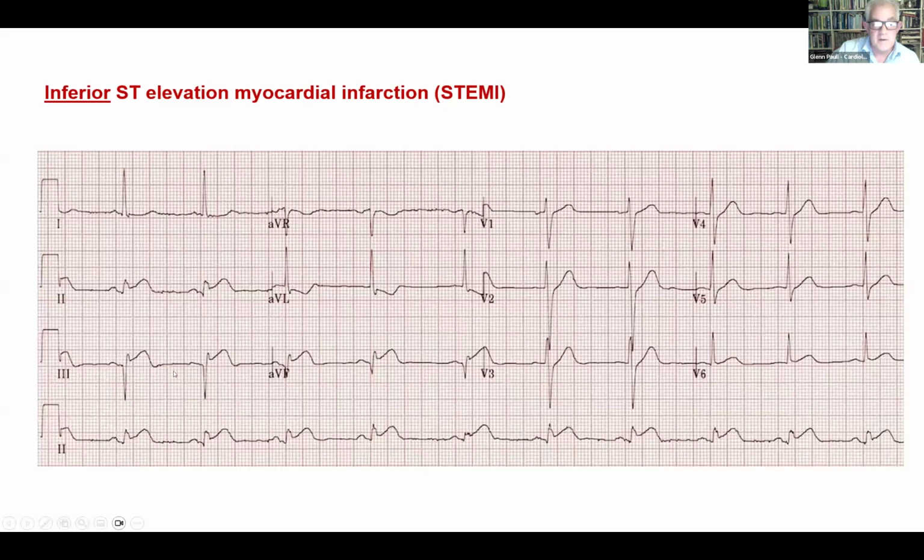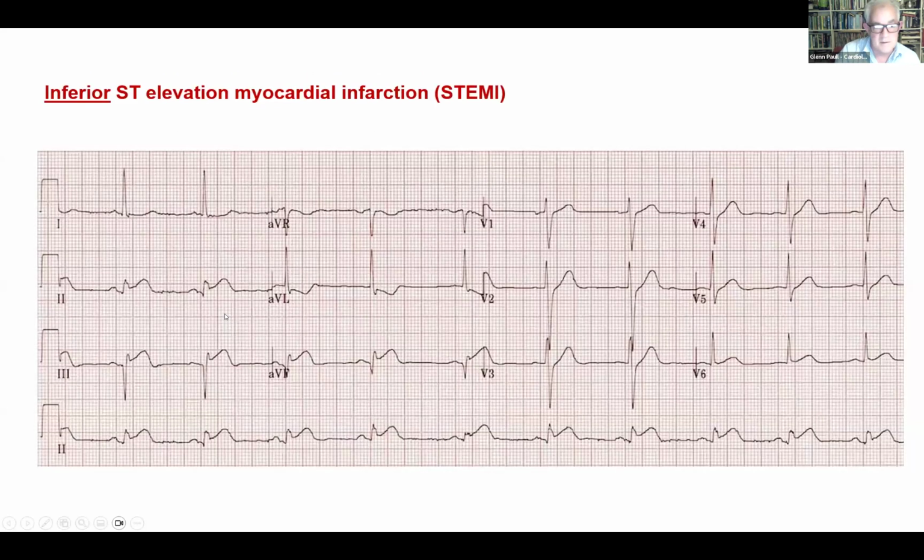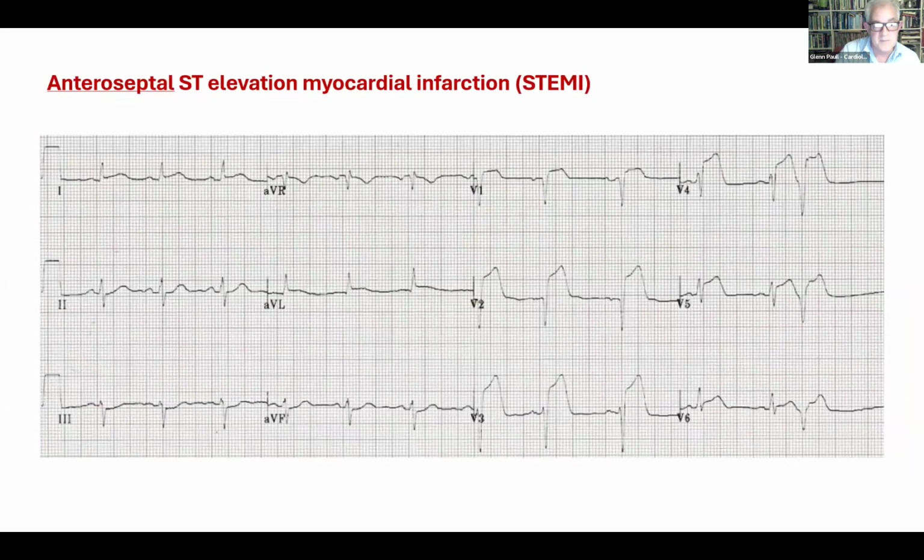This is a more evolved one where you've got the establishment of these Q waves. So it's an older one. If this presented, we'd expect this person probably would have had pain the day previous or probably greater than 6 hours ago, because they've actually got all these heart muscles dead. Whereas with this one, if they get taken to the lab, they'd have minimal damage because they haven't had that damage yet.